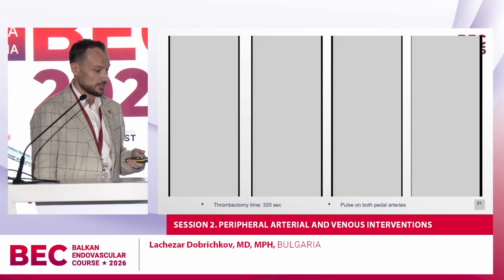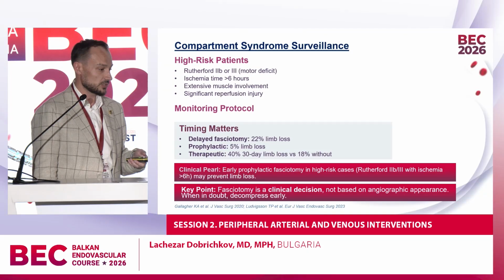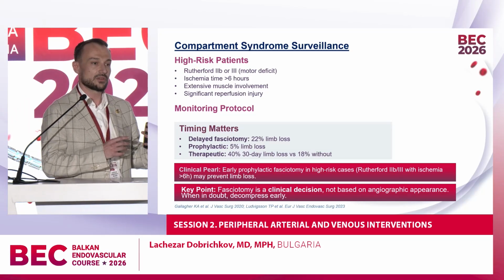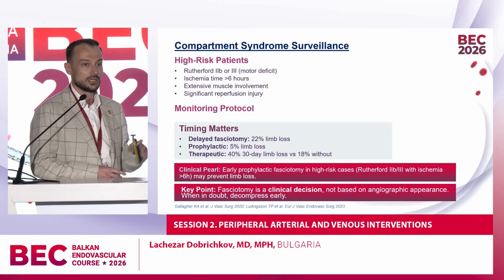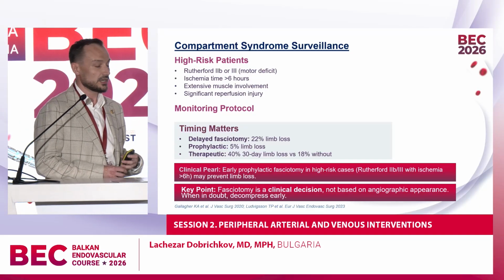Anyway, the final angio: we had the same problem, very sluggish, very slow contrast in the arteries below the ankle. So that was caused by the same problem.